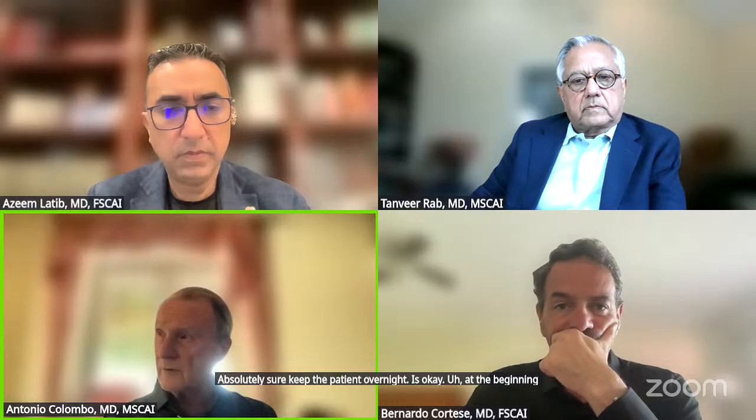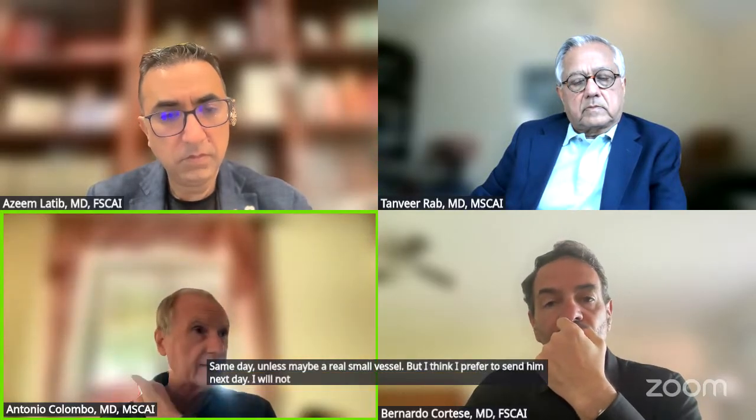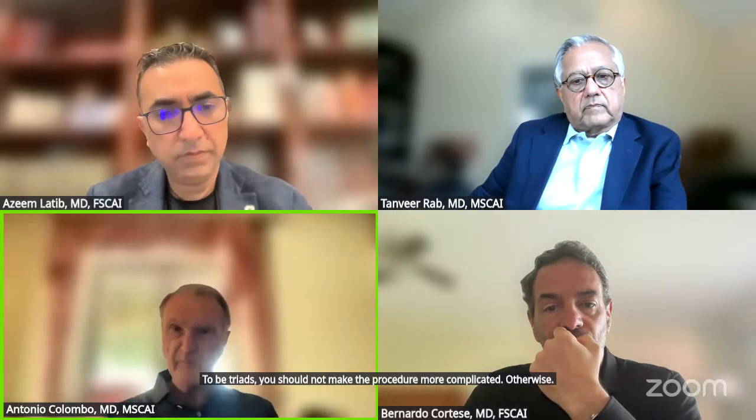Usually, I think it depends on the result. If you are not absolutely sure, keeping the patient overnight is okay. At the beginning, I will not send the patient home the same day, unless maybe it's a really small vessel, but I prefer to send him the next day. I will not give extra heparin. I will not give 2B3As. You should not make the procedure more complicated. Otherwise, you place a stent. No, we're on the learning curve.